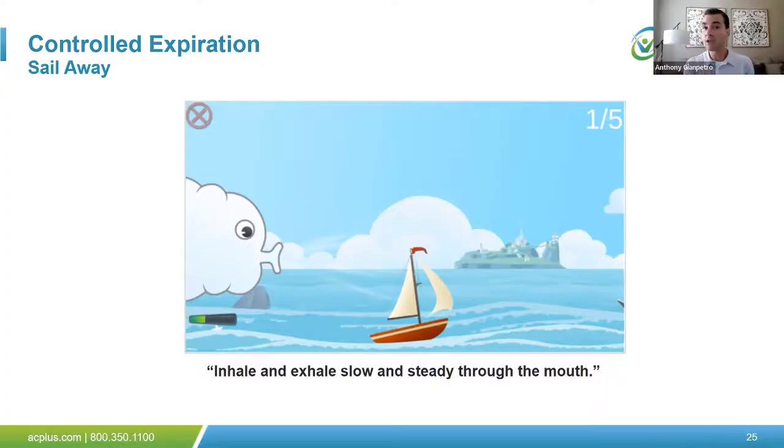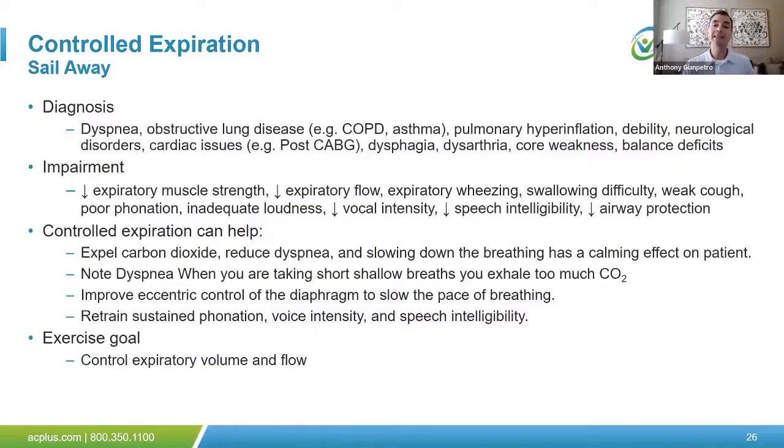So enter Sail Away. Sail Away is an amazing activity where the patient visualizes themselves on the left-hand side of their screen, this time as a cloud, and they're going to be blowing on the sail of a boat to try to speed it over water. Really clever. So it's like a virtual adaptation of pursed lip breathing. And you see all the indications here, we went through a lot of those, but the big thing again here is expiratory muscle strength, for all the reasons we talked about before and just recently.